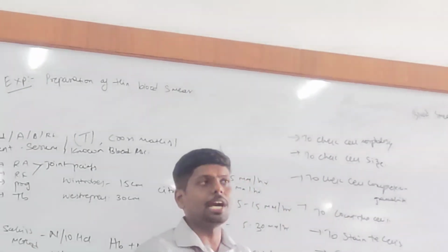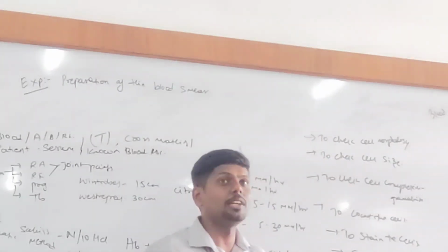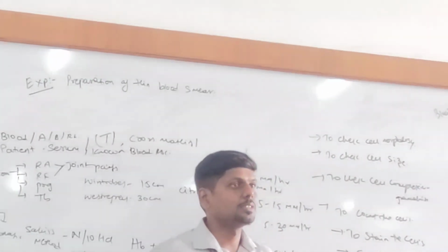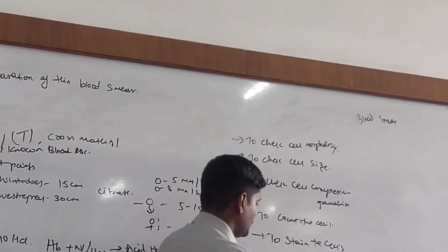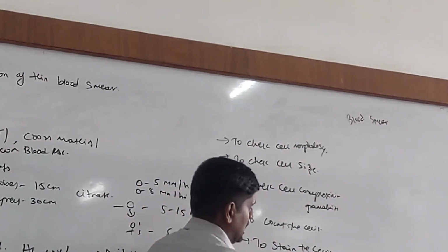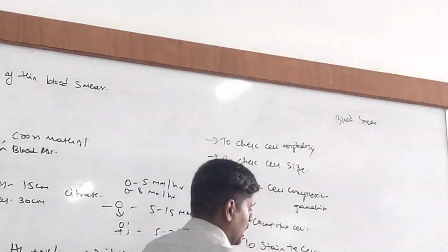Any other thing you can add here? Purpose of blood smear preparation. Any other points? And to preserve the cell abnormalities or morphologies.